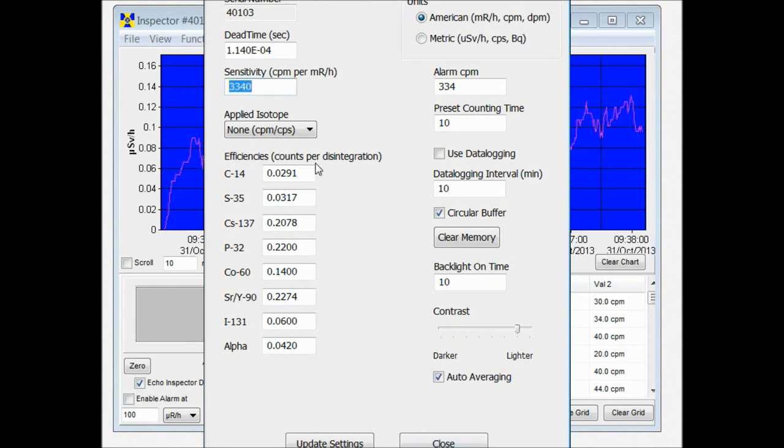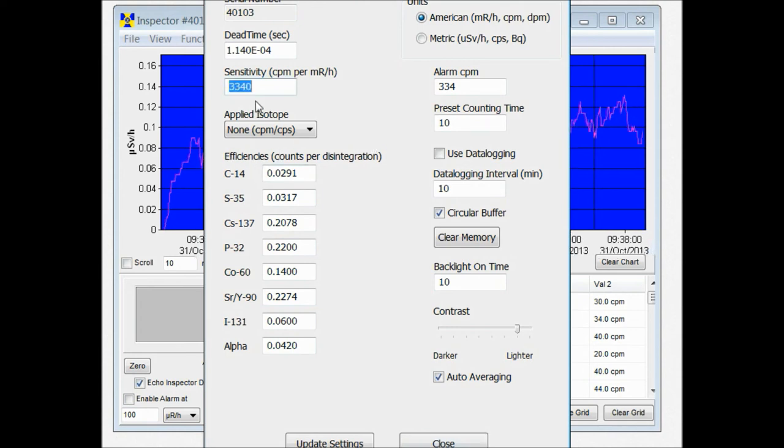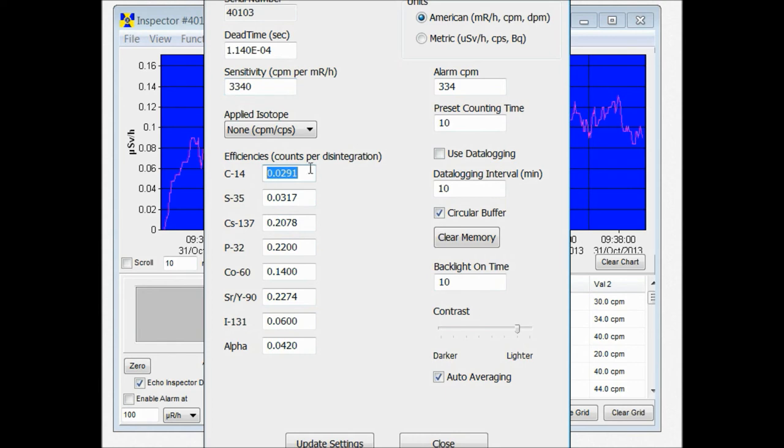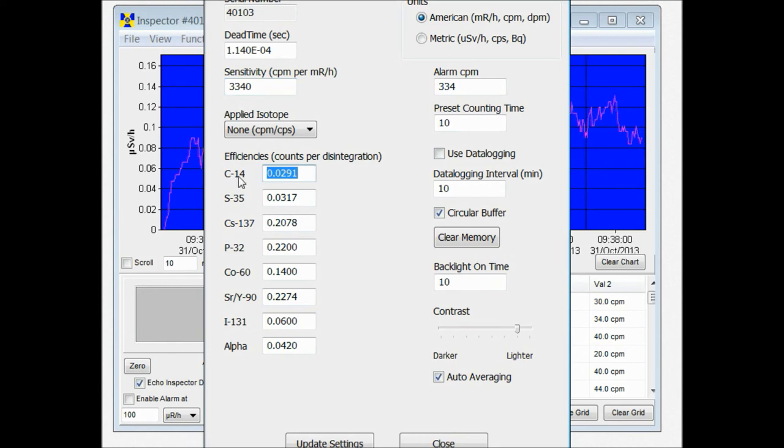Now right here we're looking at the efficiencies that are pre-programmed into the unit. Just because they're labeled with a specific isotope, you can actually change those efficiencies just as long as you remember which isotope you used as a marker for that.